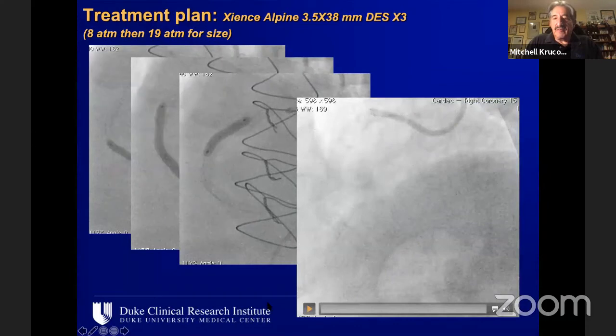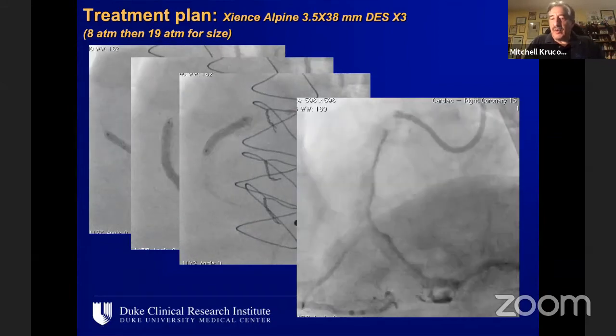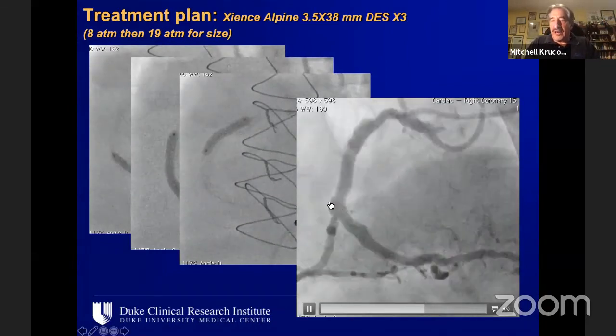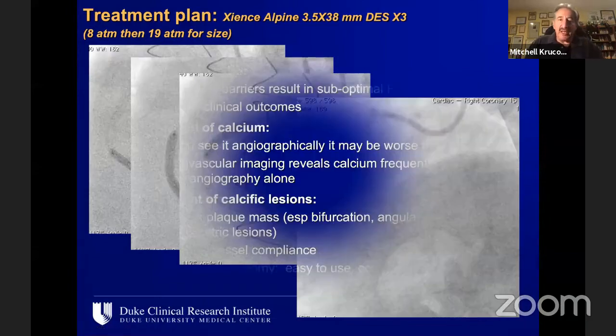And the final result. So I'm happy to say she did well. We didn't, of course, chase some of these larger than 4.0 areas in this very ectatic vessel. She did well and was home the next day.